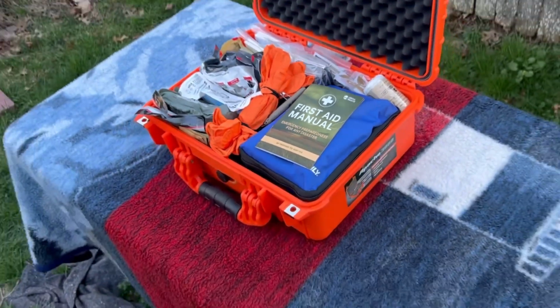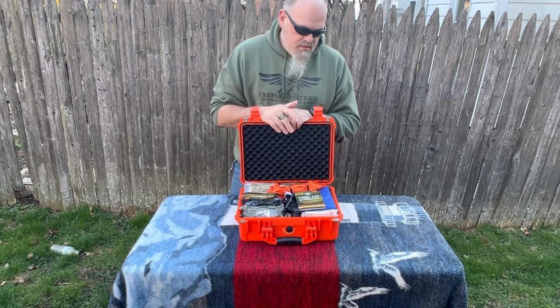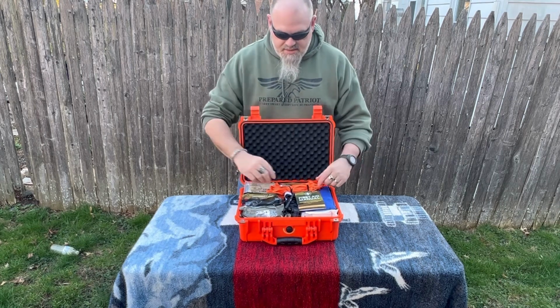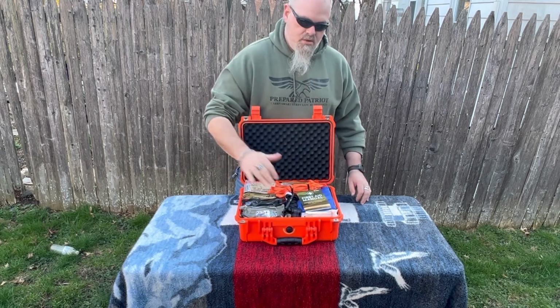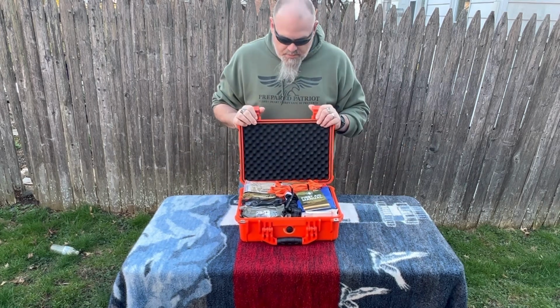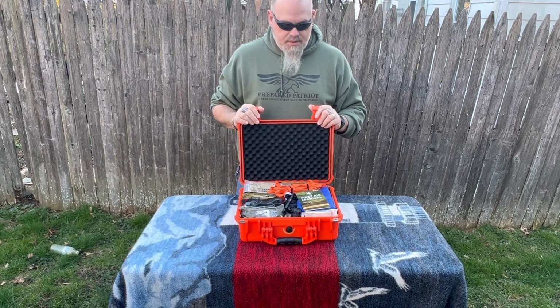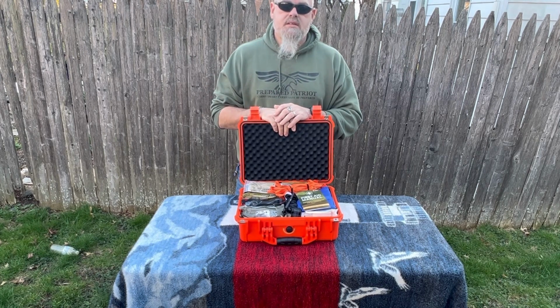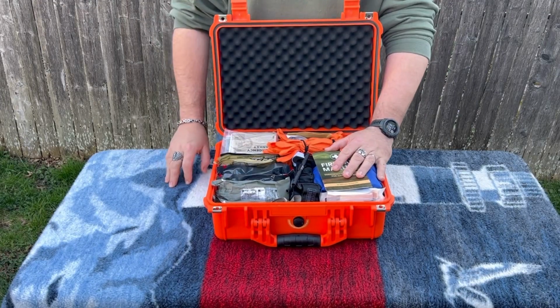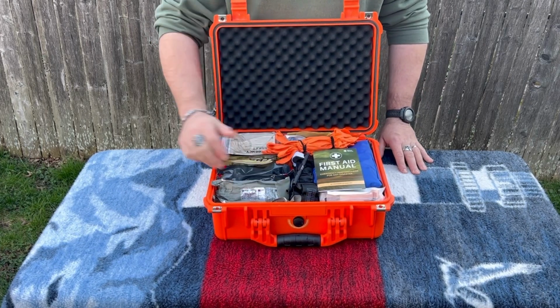Pretty comprehensive kit that's in here. We're going to be pulling everything out, going over everything that's in here. I'm going to bring it a little closer for that. But basics, major trauma here, first aid here, tourniquets in the middle. So pretty straightforward as far as how it's laid out. Nothing terribly fancy about that. All right, so we're going to bring the camera in a little closer. We're going to take a look at the contents, get a better look at what's in here. All right, so again, basic layout, you have tourniquets here, you have major bleed trauma here, and you have first aid here.